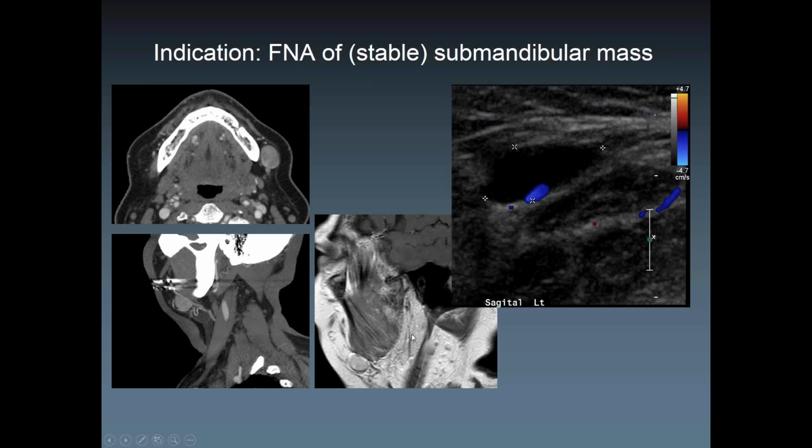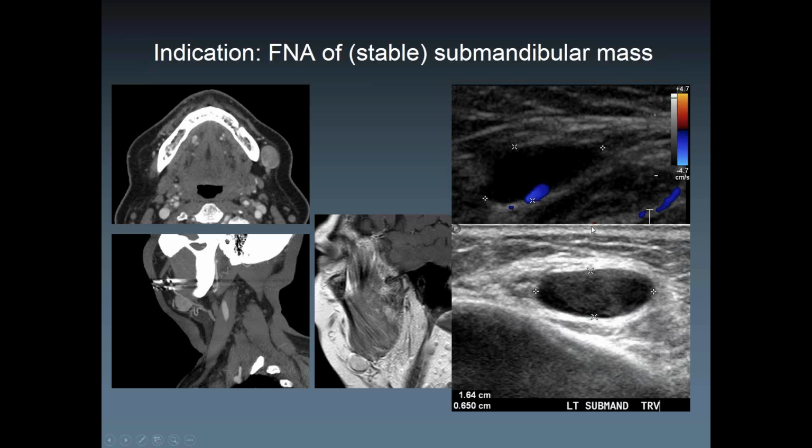On ultrasound, because we were to do that with ultrasound and Doppler, you can see it would be hypoechoic and some flow in the periphery of that or adjacent to that. It was kind of hard to say. And it's pretty low scale already. So remember, the lower the scale, the slower flow you're going to pick up, right? If the scale is too low, you're going to end up with artifacts too. So you have to kind of titrate finely how to get to the ideal scale.